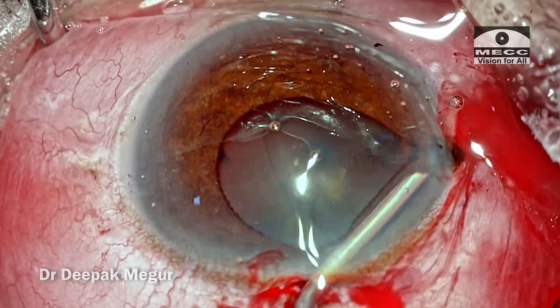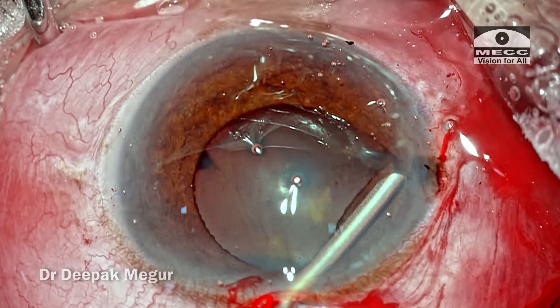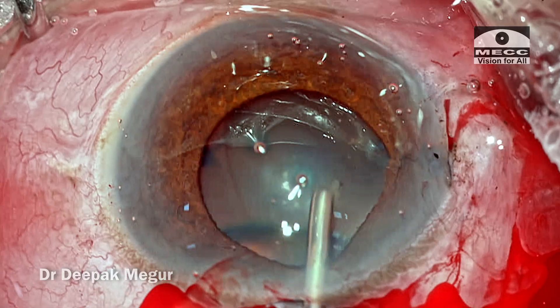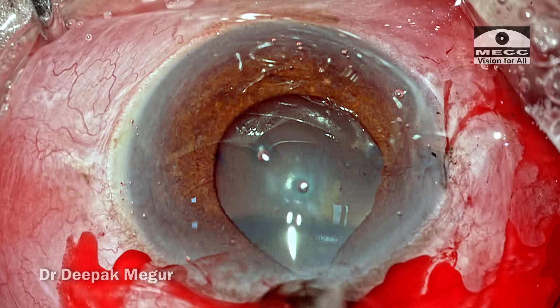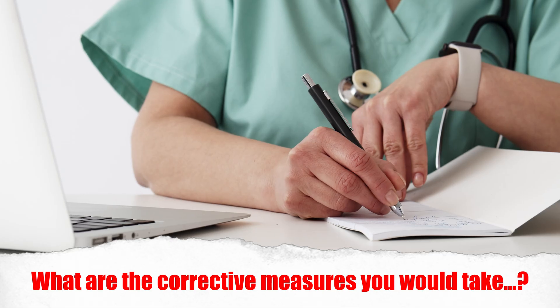The surgery has not even started. The rhexis has not even been done. So what caused the problem, and what was the error in the way it was being managed? If the iris is pouring out from both the incisions, how are we going to proceed with the surgery? I'd like all the young surgeons to pause the video here and write down what corrective measures you would take to continue with the surgery.